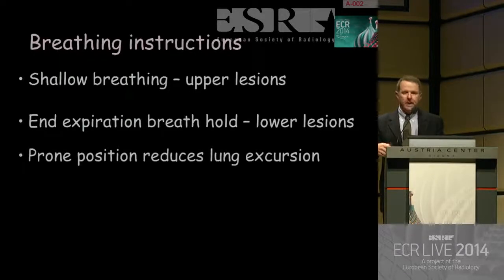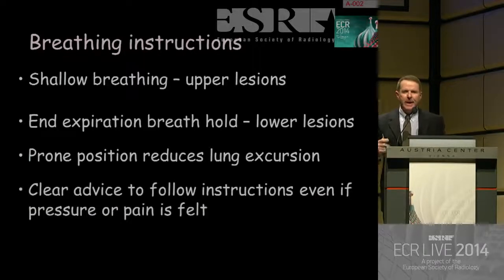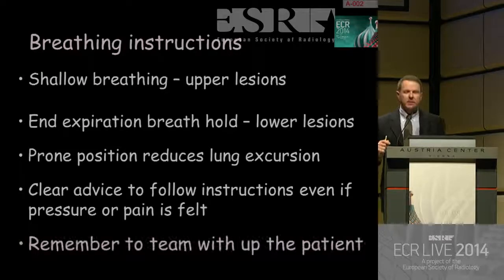Okay? The prone position for sure reduces the lungs excursion, but you've seen where we may have other problems of positioning. Give a clear advice that he or she has to follow the instruction even if she feels pressure or pain. Because at a certain point, she or he will have pain, and you want him to hold his breath the same time he did without pain. Altogether, remember to team up with your patient.